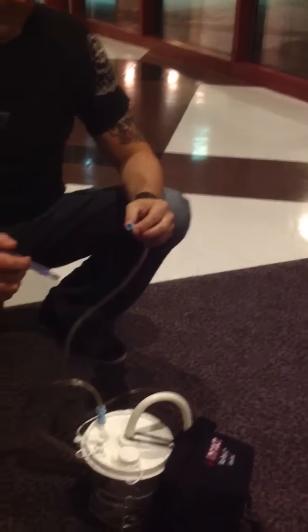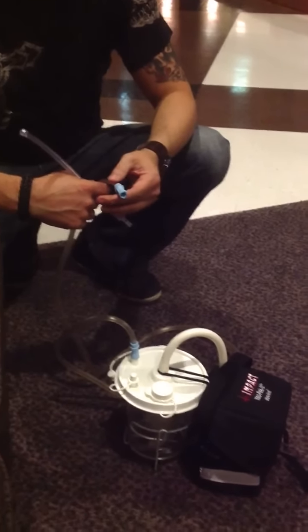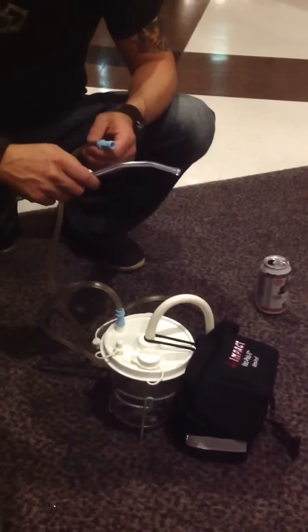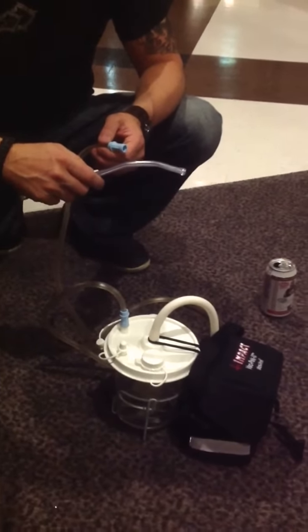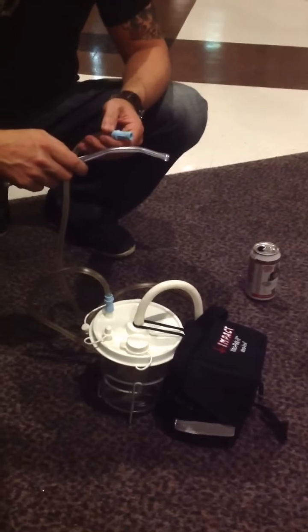It's also important to have a container of clean water nearby, so that in case there are any chunks of material that get clogged in the tubing, the water can be used as an attempt to flush it out. And the final aspect is the actual suction tip.